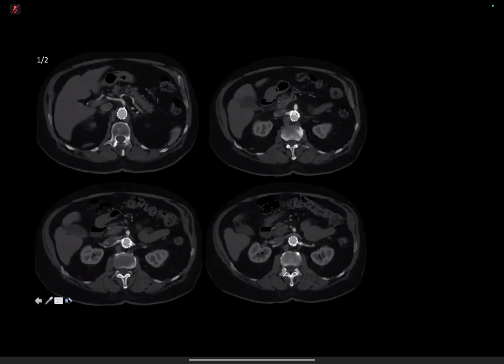Okay. So, the right renal artery, you have a right retrocaval renal artery which appears to be patent, although slightly lower attenuation within, I think, is artifactual. So in the top right image is an area of increased density within the actual aortic lumen.